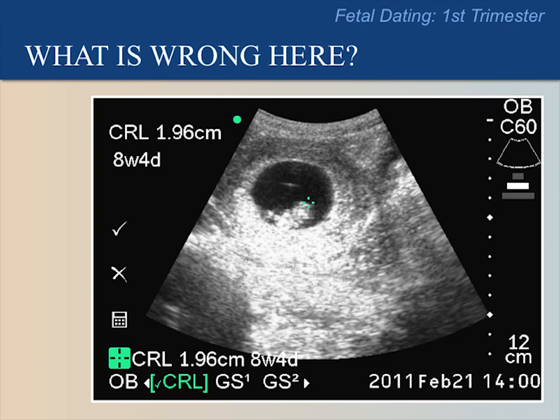What is wrong with this image? Please pause the video to ask for reasons why the image appears poor. The answer is that the gain is too bright in the mid and deep zones and should be adjusted. We can't see the fetus well enough to accurately place calipers.